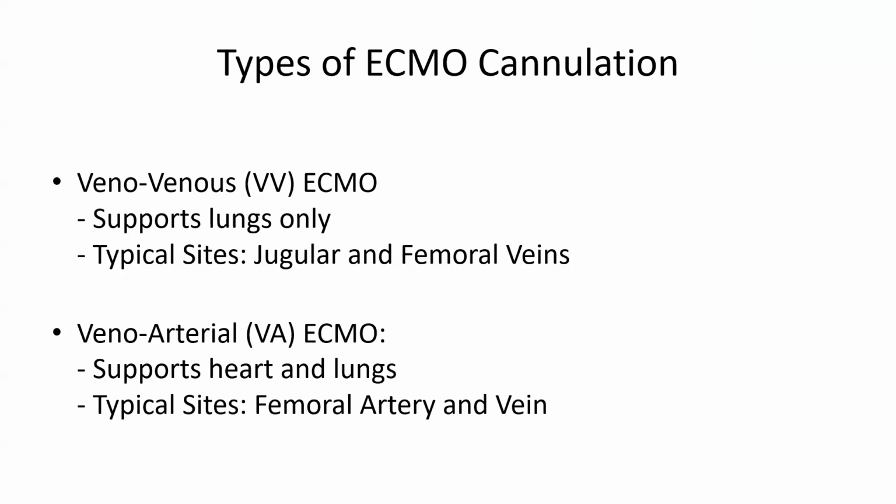So the last VA and VV and the physiology has made my talk much easier, and I'll try to stick to the time. In the next 15 to 20 minutes, we will be discussing a little bit about the ECMO cannulation.